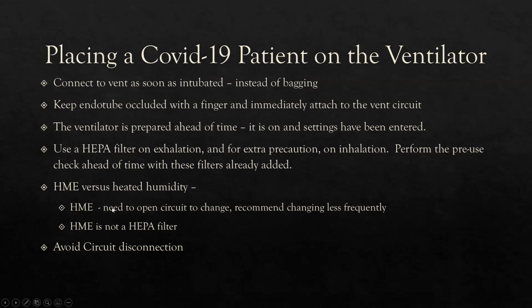And then should you use an HME or should you use a heated humidifier? Probably better with heated humidity because you don't have to disconnect the circuit to change the HME. But if there is an HME in line, it's recommended that you change it less often. So I see them changing HMEs all the time on patients. Have you noticed that?